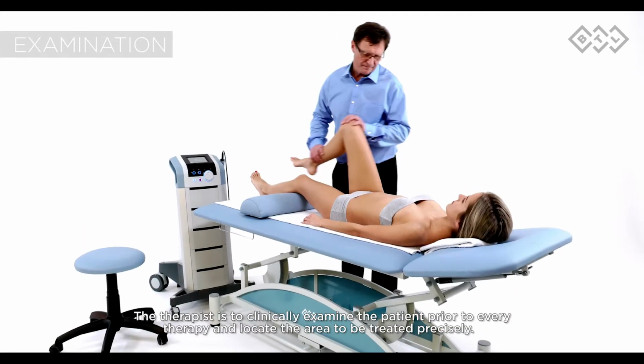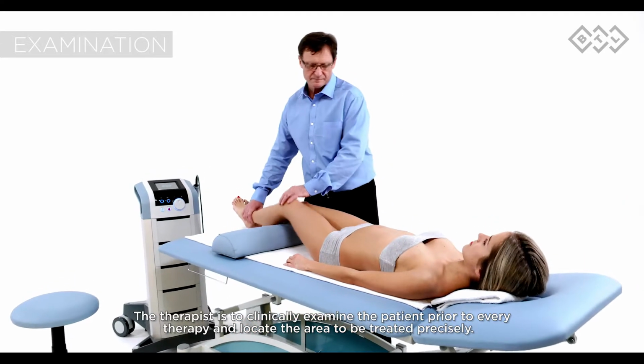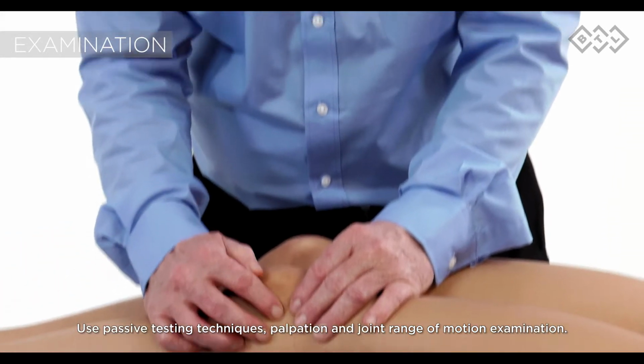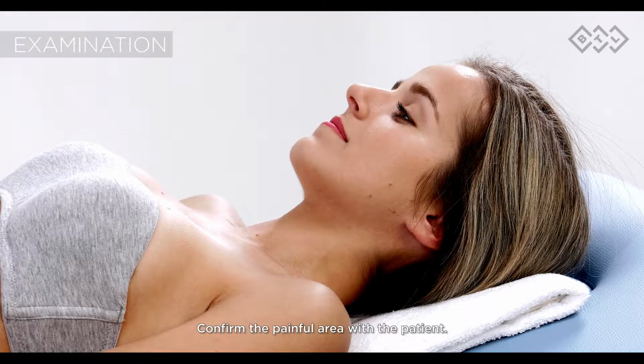The therapist is to clinically examine the patient prior to every therapy and locate the area to be treated precisely. Use passive testing techniques, palpation and joint range of motion examination. Confirm the painful area with the patient.